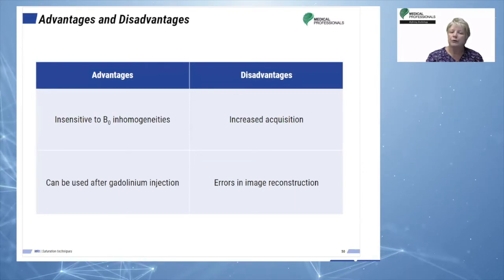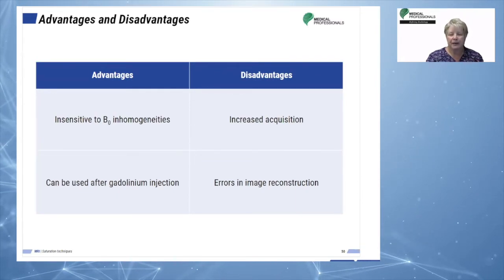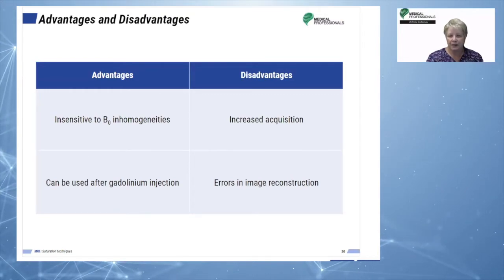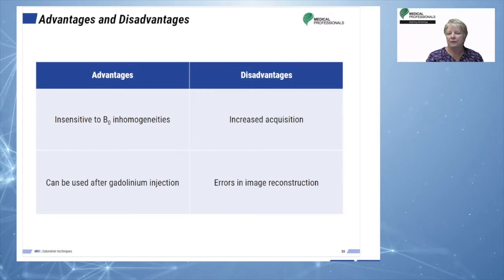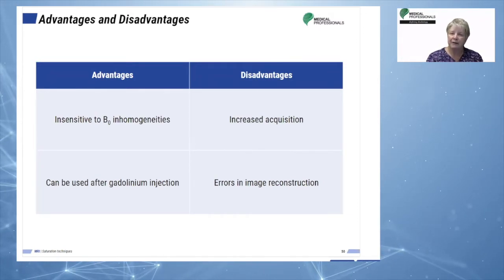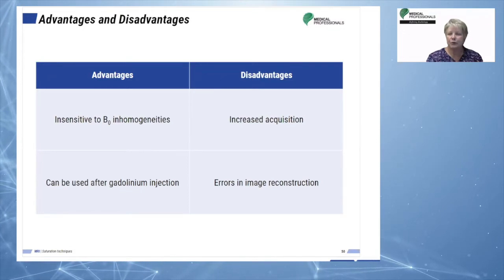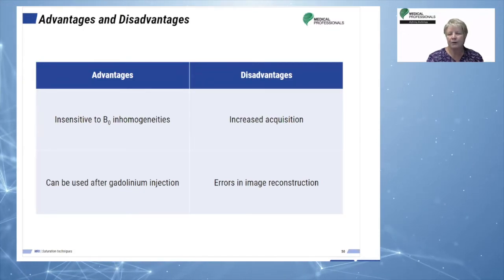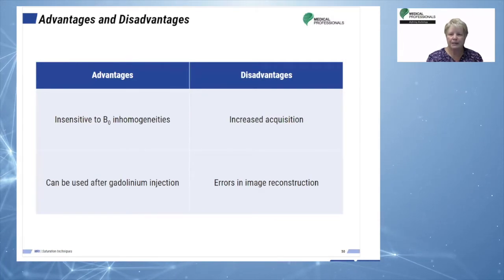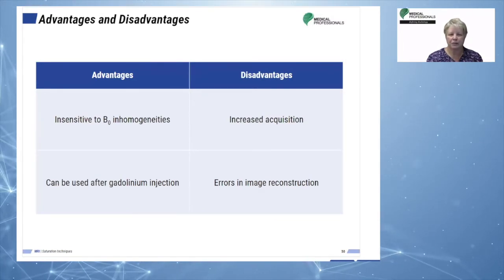If we were to do all 4 sequences separately, that would definitely add a lot more time than what's added for this particular sequence. There are also often errors in image reconstruction. So remember, we have an in phase and an out of phase. We're using those to create a water only or a fat only image, and they're reconstructed images, and sometimes there can be issues with the reconstruction.